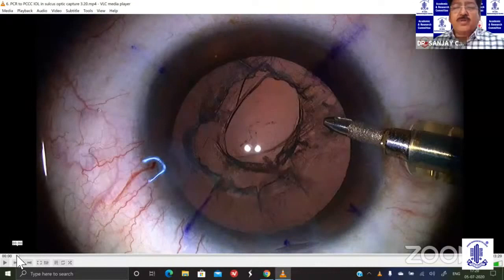What I'm talking about is a little more advanced steps in the management of a posterior capsular rent. Here you see a posterior capsular rent with a lot of cortical matter still inside, and this is a typical puncture of the posterior capsule when the phaco tip hits it. Now the question was, how do I prevent this rent from moving towards the periphery, and how do I do the minimum of manipulation to get a good acceptable outcome?